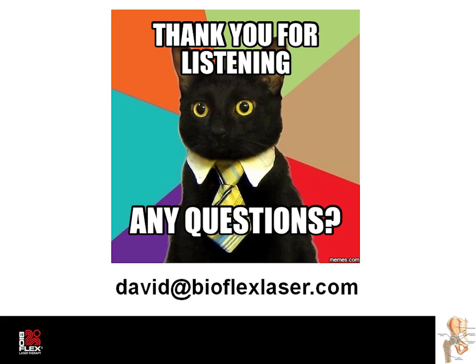If a patient is returning after some time for continued treatment, can you start where you left off, or should you dial it back and start at the beginning settings? Good question from Zara McDonald. What we tend to do is when the patient comes back for continuing treatment, if it's not an acute flare-up, we'll go back to roughly the stage 2 setting, not right back to stage 1. If it's a really acute flare-up, maybe go back to stage 1.